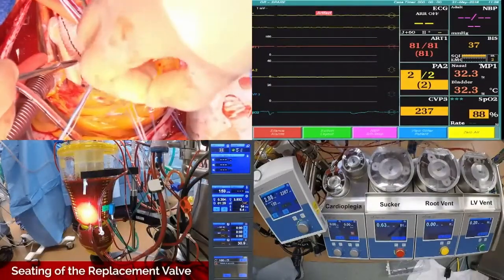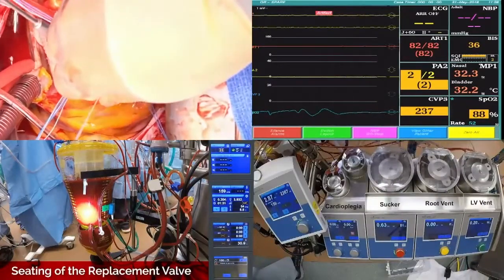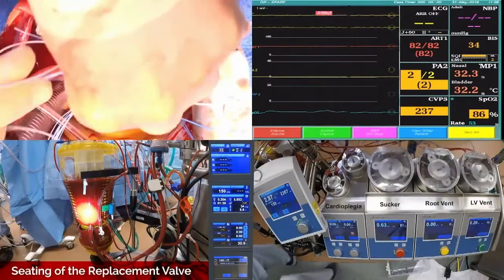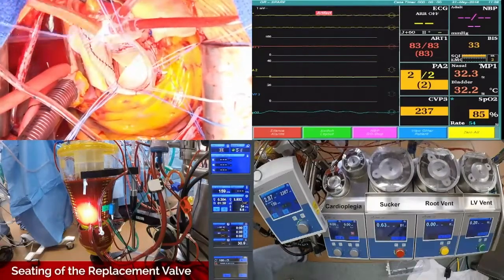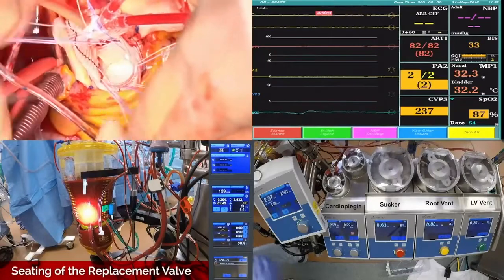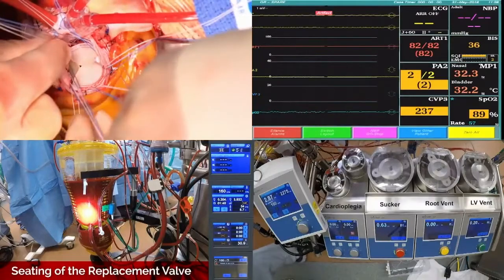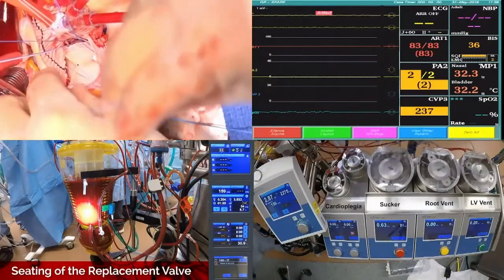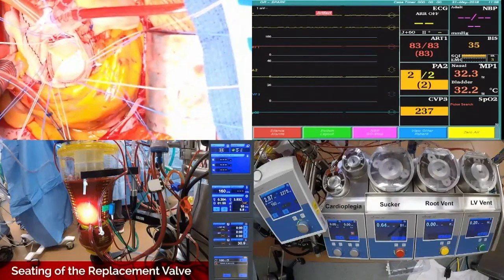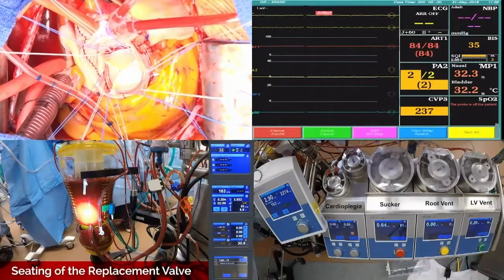And here's the part coming up in a minute that I wanted to see. We're releasing the strut here for the stick. They're all valves on a stick. How do you release it from the valve? There are 3 proline sutures, basically proline monofilaments that are attached to it with that little plastic birdcage looking thing on top with the metal handle. The metal handle screws into that, and then you just cut those and it pulls everything out.